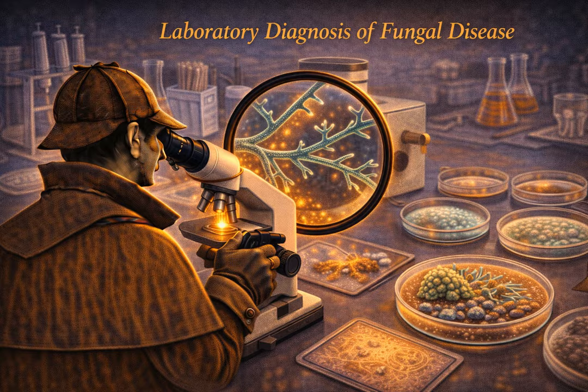So let's play this specific clinical scenario out. You have that DKA patient in the ER with a black sinus lesion and eye swelling. You order a beta-D-glucan blood test because you want to be thorough and rule out fungus. It comes back negative. And if you don't know the biology, you might falsely think, oh, phew, it's not fungal. Wrong. Mucor is practically invisible to the BDG test. You could completely dismiss a fatal diagnosis because you trusted a lab test that has a known structural blind spot.